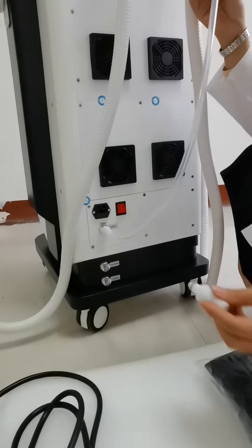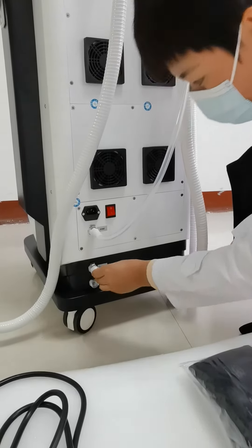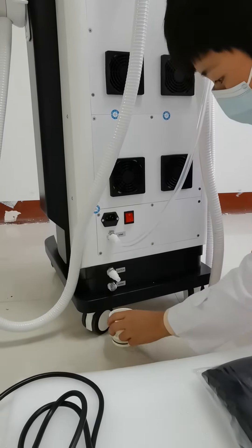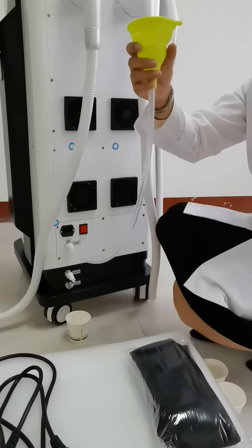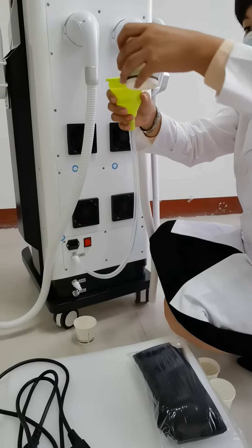And the other connector with the overflow vent. In case there is water coming from the overflow, we can put something underneath. Then keep adding water inside the machine.